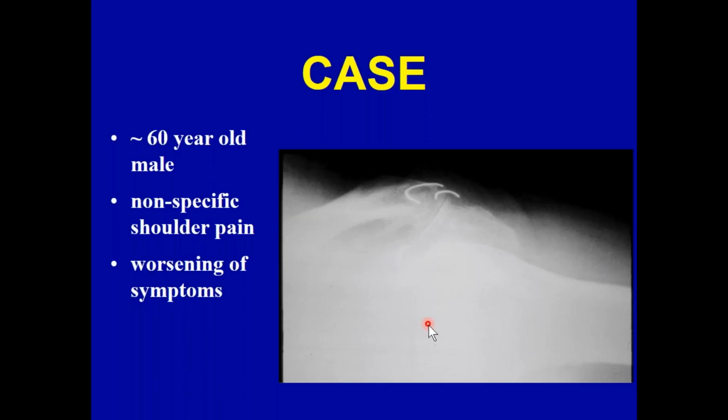So if you said to me, well, I used 70 KVP, I was in that area, then the next thing to look at is how much time did you set your machine at to produce this radiograph. So in the one scenario, was the KVP optimal? Fix that first. If it was optimal, then this has to be increased in terms of MAS.